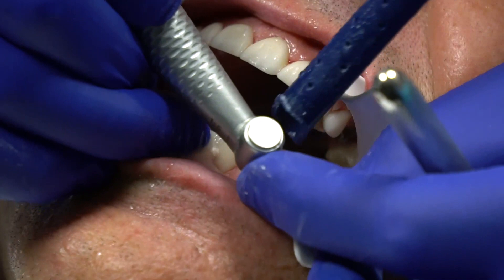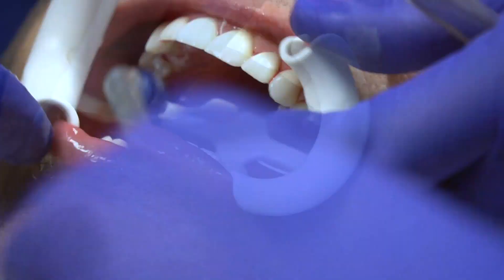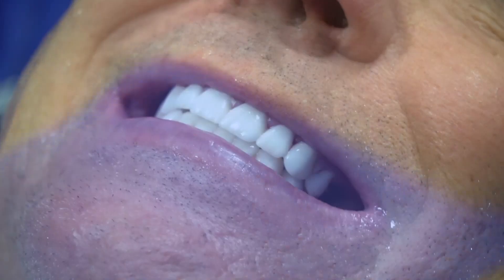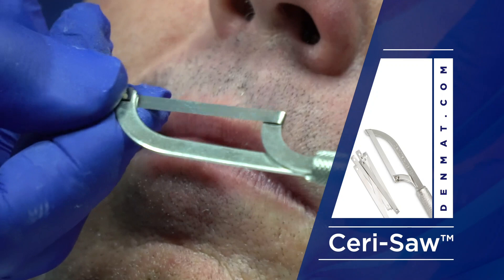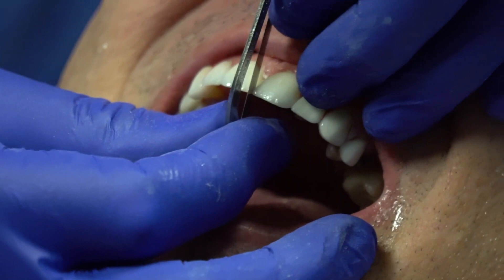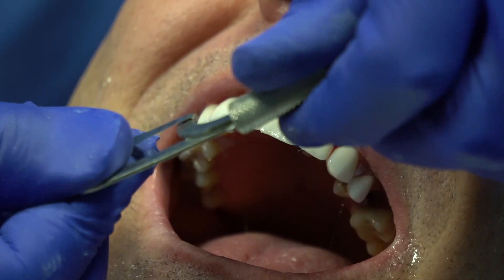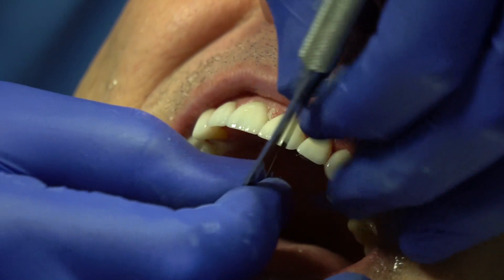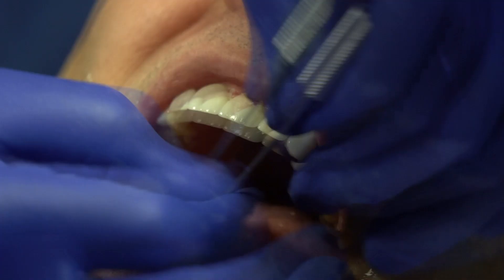So we just placed 16 veneers in about an hour. There is a seri saw with little grits on the end of it. You go in between here — don't hold it here, this just tightens it. Tighten it fairly firm, not super tight. Grab it right here and go back and forth, and if you can't get through you rock down. That cleans it out.